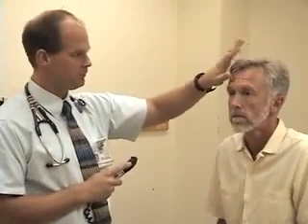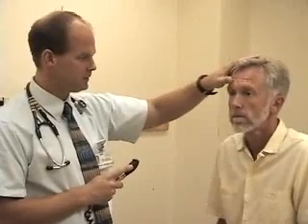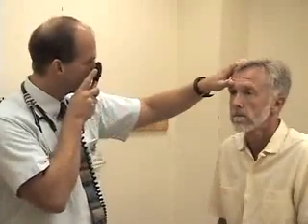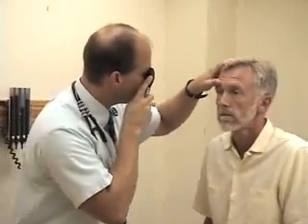Okay. If you can find something that's at about your eye level, perhaps something right about there, I'm going to have a light that's going to be kind of bright in your eye. As best you can, just stare right past me. Okay. Now, I'm going to use my left hand here both for my own proprioception and to steady the patient's head. Also, that way, if I bump into something, I'm going to bump into my thumb and not his eyebrow. And I'll get back here and check for his red reflex, and then gradually come in. And if I'm about 15 degrees from the midline, I should come in right on his optic disc.